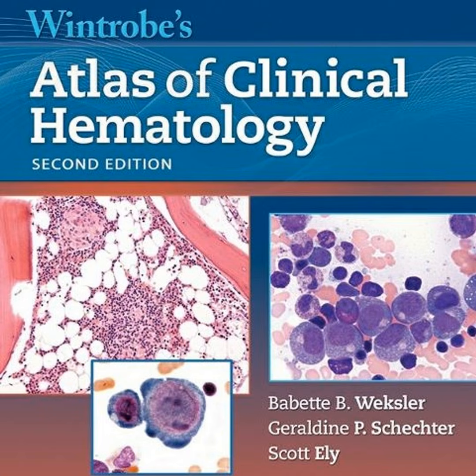So moving from the periphery into the marrow itself, the bone marrow evaluation. You need two complementary pieces of information here, the aspirate smear and the core biopsy. What's the specific role of each one? The aspirate is liquid. It gives you superb cytologic detail, the fine grain of the cells, and that's essential for things like flow cytometry and molecular analysis. You have to see those little gray specks, the marrow particles, to know you have a good sample.